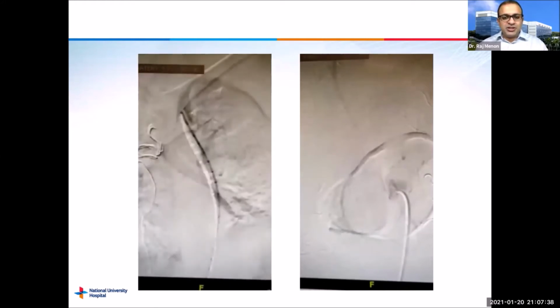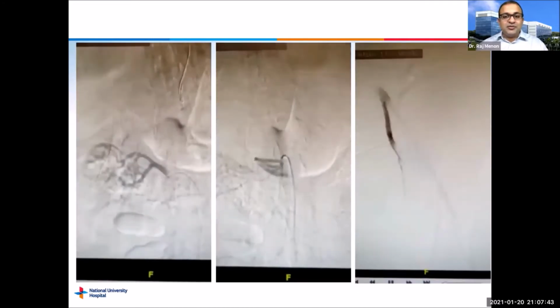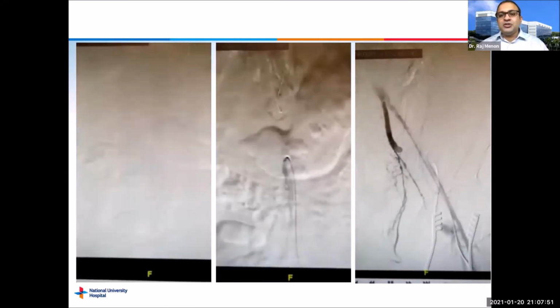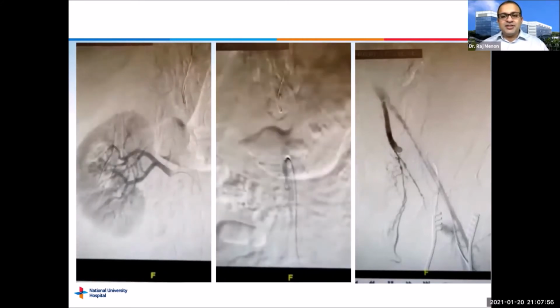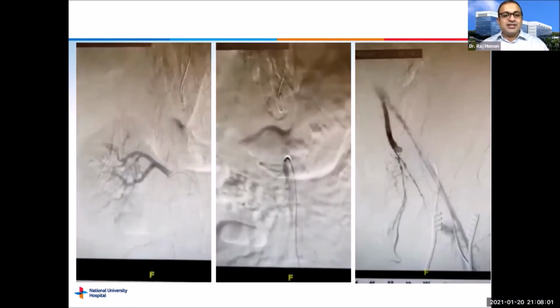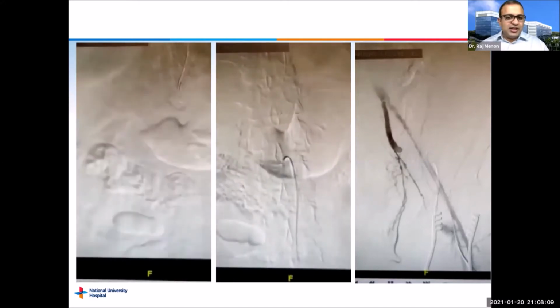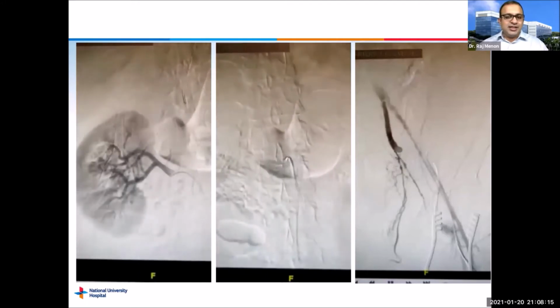So this is quickly running a catheter up to make sure there's no aortic injury. Similarly, we check for other areas of bleeding from various other parts of the celiac axis and other areas of concern, especially in this context of a patient who has had no scans before. We're not sure whether there's any other bleeding going on. And here it gives us a very quick way of doing both open surgery as well as using this endovascular access to quickly go in and embolize vessels at the same sitting while we're there. And this demonstrates not just the diagnostic, but the therapeutic roles of an endovascular intervention in this setting.